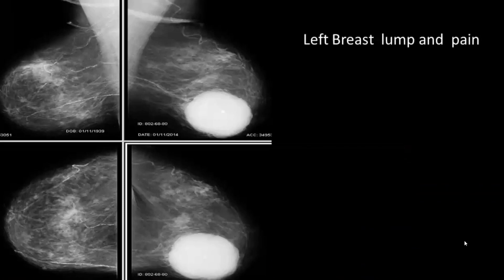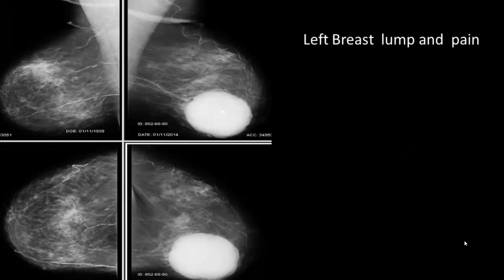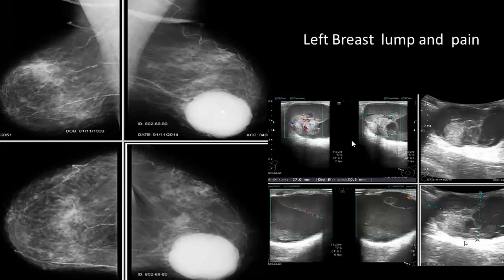Another case — left breast lump and pain. Since there is lump and pain, give it BIRADS 4, because this lesion is very dense. A cyst will not be this dense. Don't give it BIRADS zero because this looks suspicious — she is an elderly lady. Ultrasound shows a solid-cystic lesion. Doppler images show vascularity in the solid component, making this definitely a malignant lesion — BIRADS 4C.